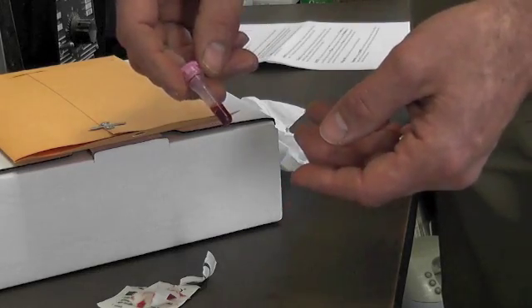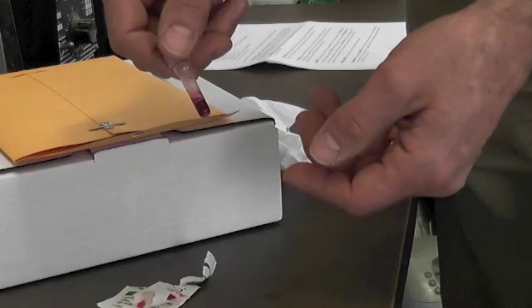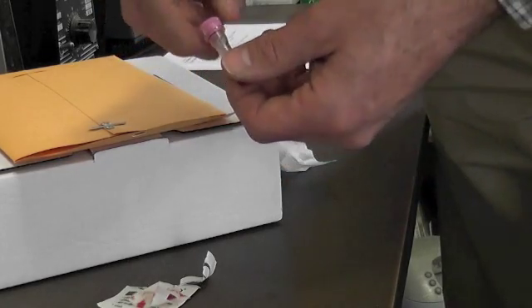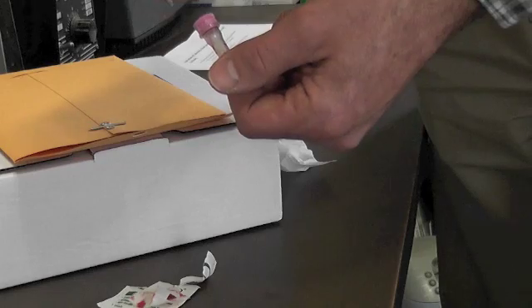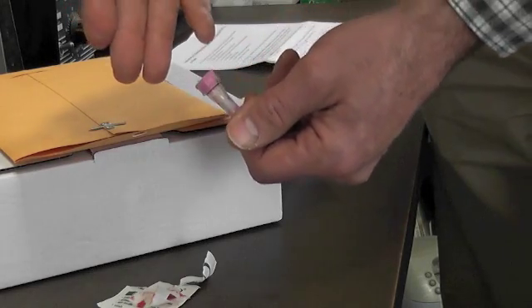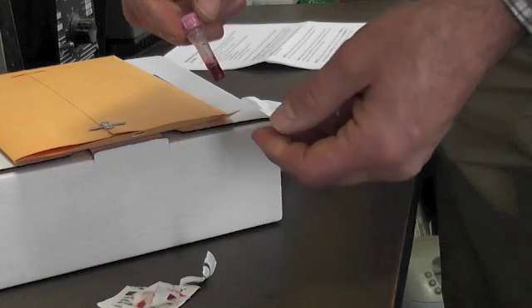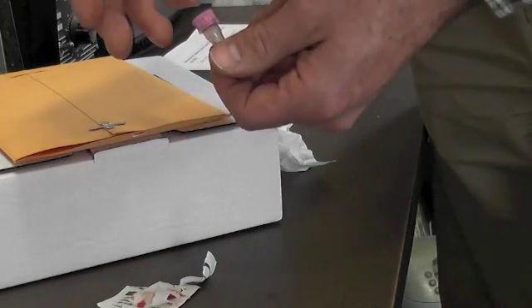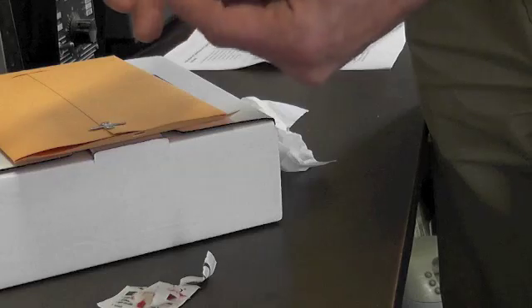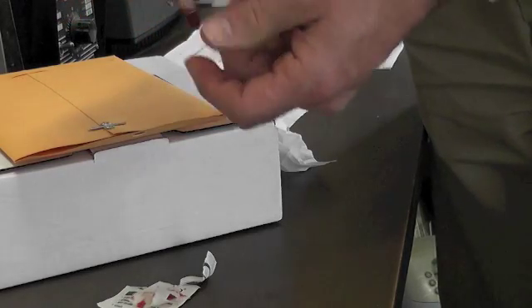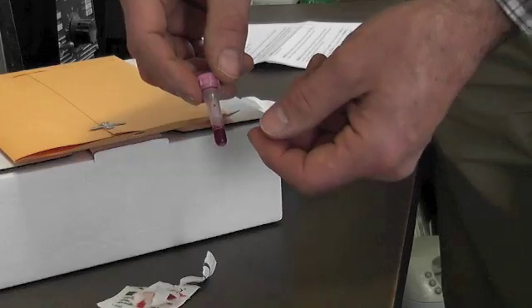It won't come back and say insufficient sample because you've given them a good sample. Now you know how to do that. Don't touch your finger to the side of it, just let the blood run down. Get a nice hanging drop and drop it down there. That's the main key. Get a good finger prick, let the blood touch, don't touch your finger because it slides all over the place. You can get a big area that's full of blood and it doesn't drop very well at all.